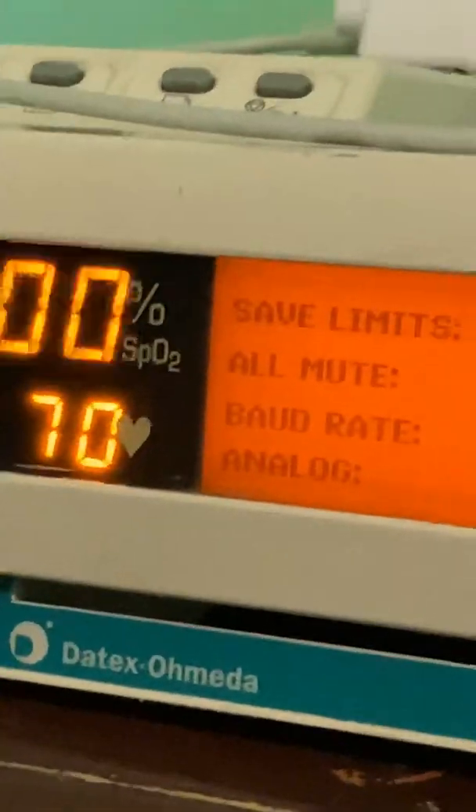But if you have that set to yes, as in my case, if I adjust the alarm settings and I turn off the machine, when I turn it back on the alarm settings will be what I had set them to. There's also bod and analog settings, which I don't use because I don't have this connected to a data recorder — if I did, you would use those settings.